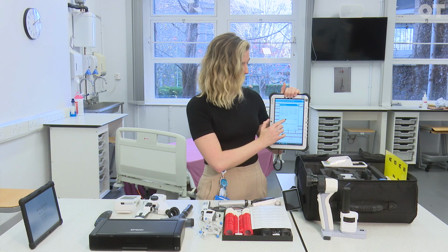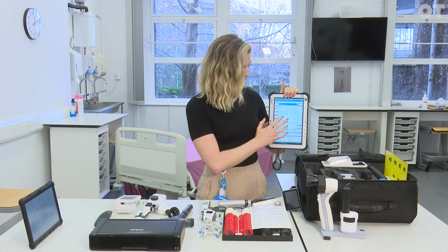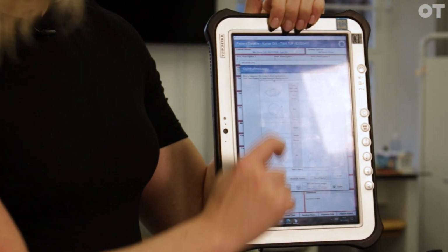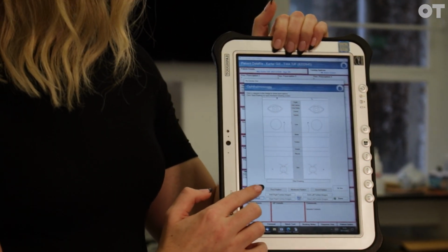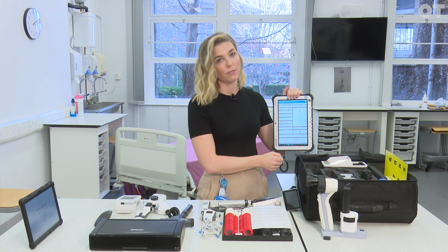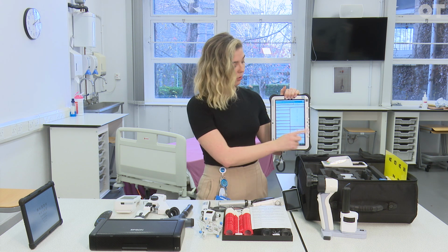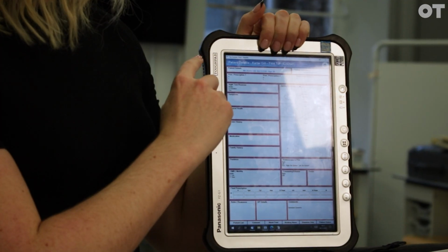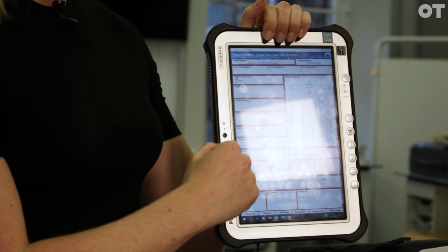If there's any additional information that you want to pop in, you can type it and it'll normally come up with a little keyboard. Anything ocular health wise, we can also draw on the diagram, so we can add little drawings onto that as well. It's a really useful feature that it all shows up on red. Once you've filled that in, the red box will disappear. You can't progress to the dispensing screen on the next page without filling in each red box. It means that anything that might come up on an audit is accounted for.